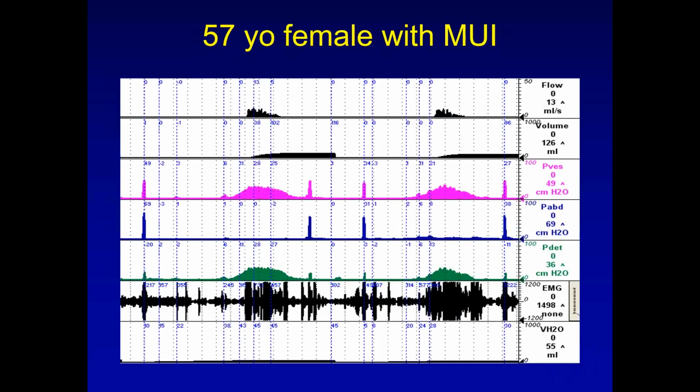This test, the pressure flow study, tells you it could be obstruction, but she's got a better flow rate here. It could be because she's holding it back, but I don't think she's got a prostate, or not meant to be a joke. But what causes obstruction in a female? A previous sling, she didn't have that. What else causes obstruction? Prolapse. But if she's been examined, she doesn't have that. So it's most likely she's self-inducing her obstruction by this extra EMG activity that she's causing.